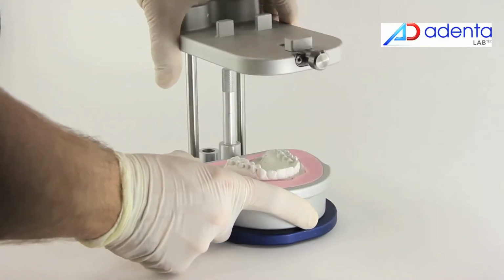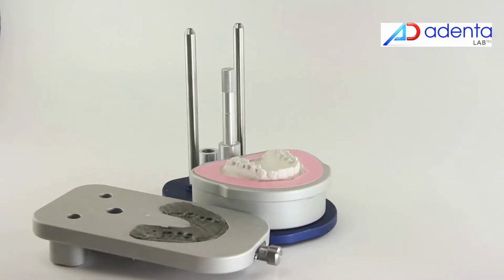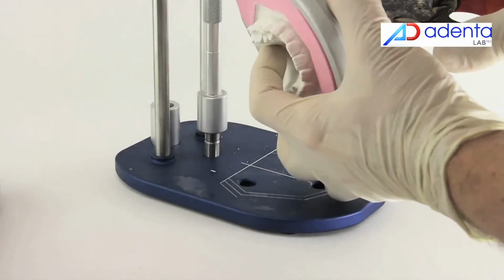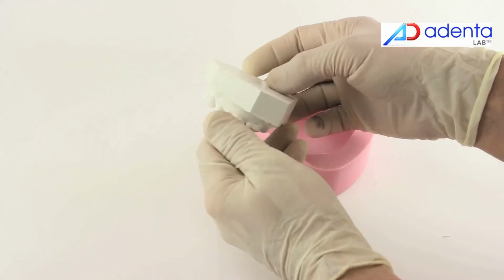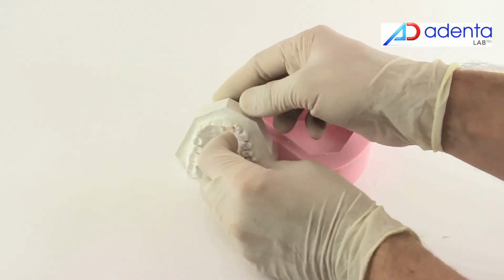When the plaster is hardened completely, the positioning plate is removed. The tray with the mold is removed. Using the compressed air, the silicon mold together with the upper model is separated from the tray. The result is a perfectly finished study model.